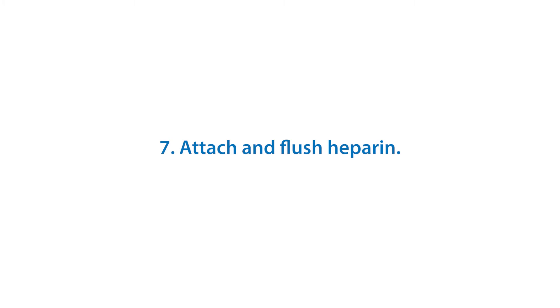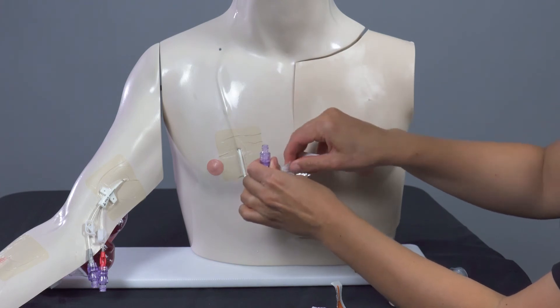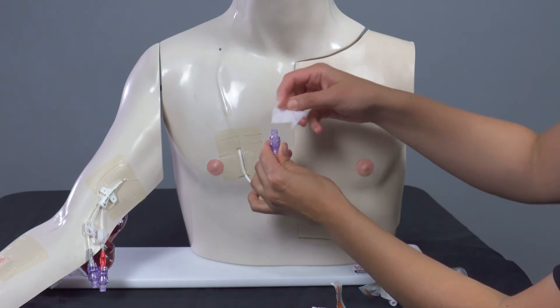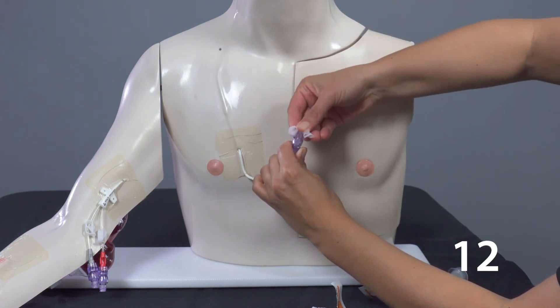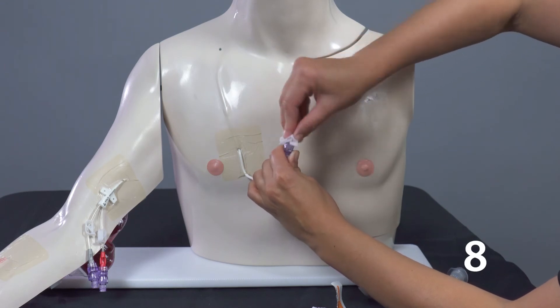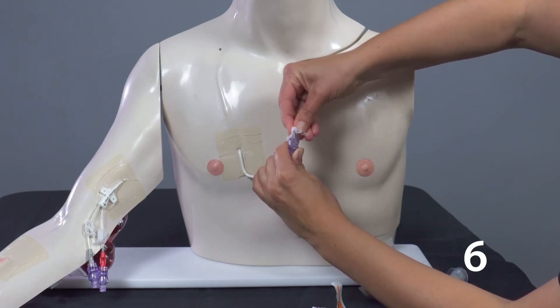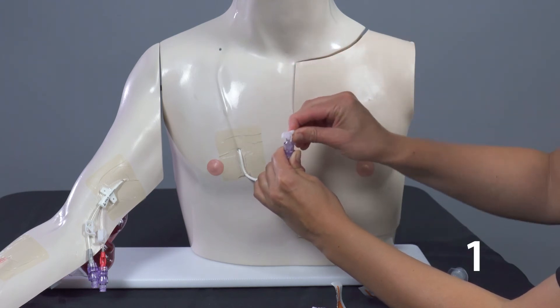Attach and flush heparin. Keep control of the line. Clean the cap again with a new alcohol pad. Scrub the end of the cap with an alcohol pad for 15 seconds. Firmly scrub the top of the cap and the threads on the side of the cap. Then let it dry for another 15 seconds.